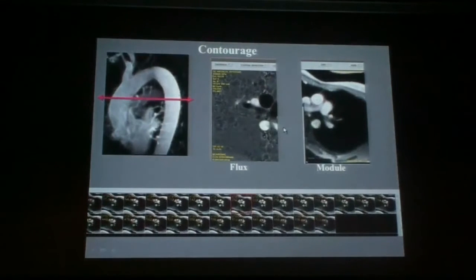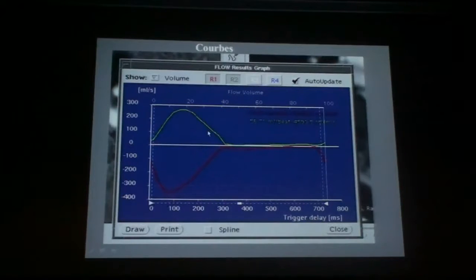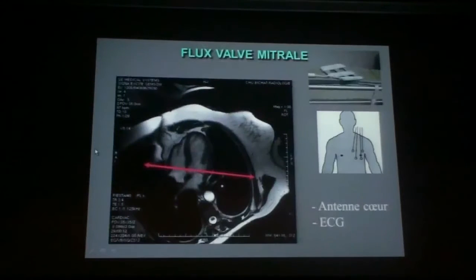Okay, and finally, for level 1, as you can see, we can also position slices to study motion in your arteries especially. Over here in the ascending aorta and the descending aorta, you put an axial slice, and you measure the phasing of your protons, so that protons that flow quickly will be highly dephased, and this high dephasing will be measurable and will allow you to measure very precisely the maximum velocity inside an artery, having at the same time the diameter of this artery, and therefore being able to quantify the flow located in this artery.